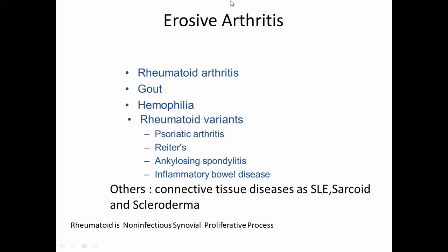In the neurotrophic type you will find lost terminal phalanges. This is called acroosteolysis. And in the infective type you can see the involvement of more than one joint with destruction, and at the same time, being chronic, there is some space for new bone formation.